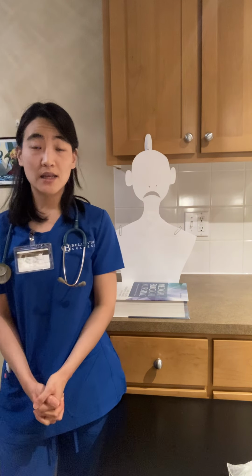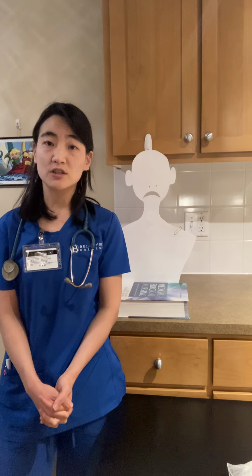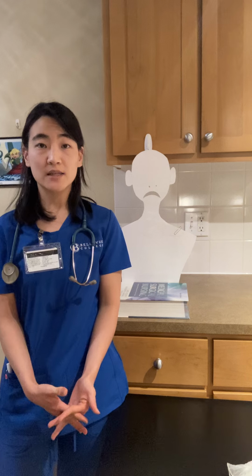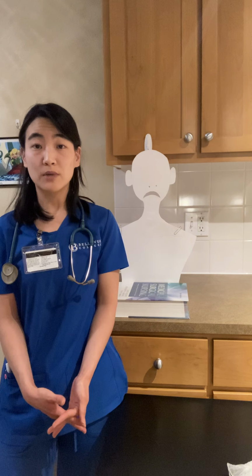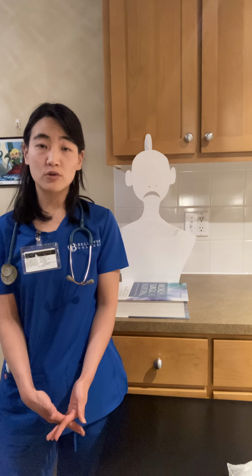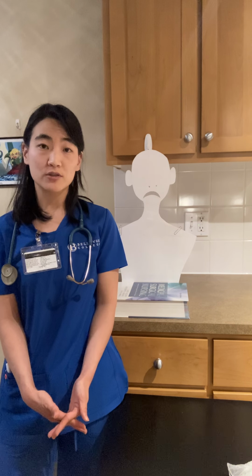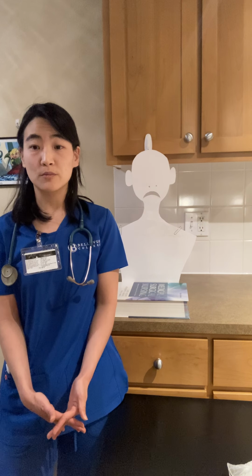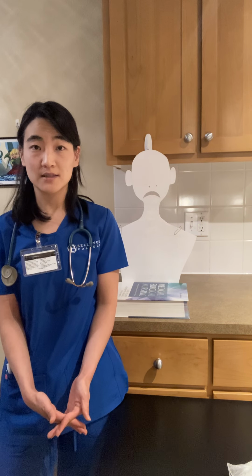My name is Yang Han, and the skills video is for the insertion of a nasogastric tube. My patient today is Tran Nguyen, and he's a patient with a bowel obstruction and an exacerbation of Crohn's disease. The doctor has ordered the placement of a nasogastric tube for gastric decompression related to postoperative paralytic ileus.